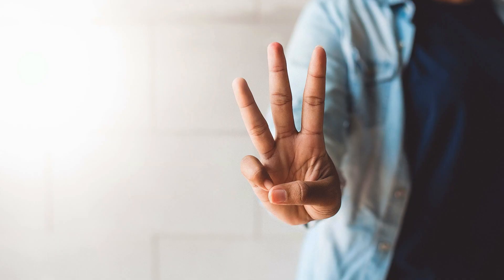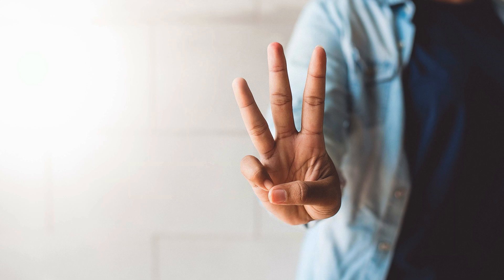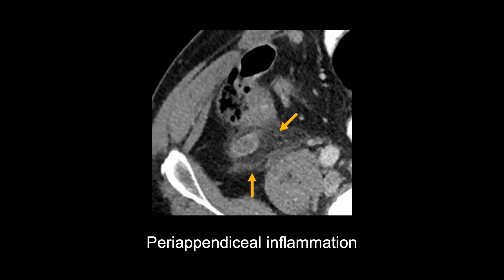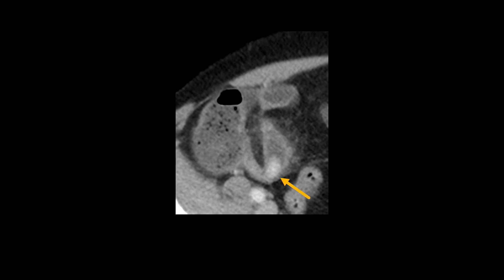There are three key imaging findings that will help you confidently diagnose acute appendicitis. First, look for a dilated, fluid-filled appendix that is greater than 6 mm in width. Second, look for inflammation around the appendix — that is, stranding or wavy lines and haziness of the fat surrounding the appendix. And third, look for a bright, calcified deposit or deposits in the appendix. This is the appendicolith, and it can obstruct the lumen and be the cause of appendicitis.